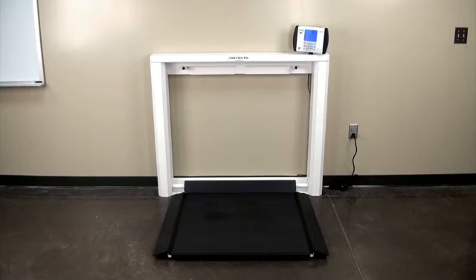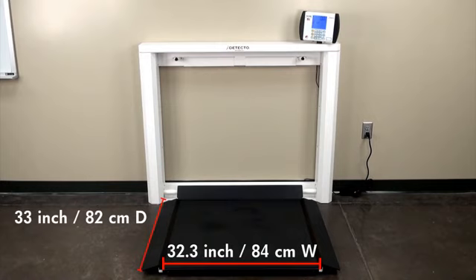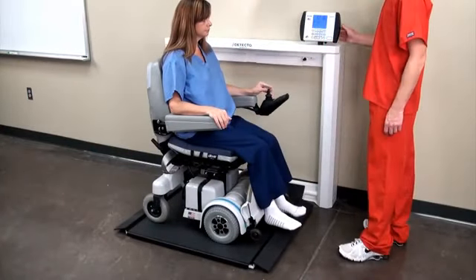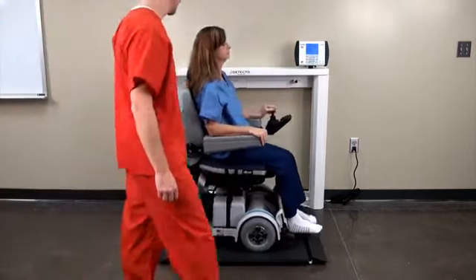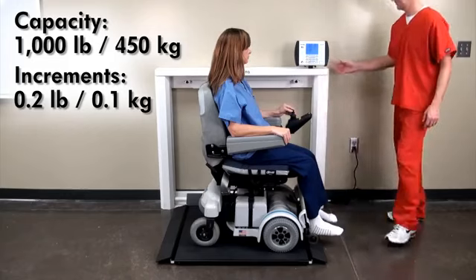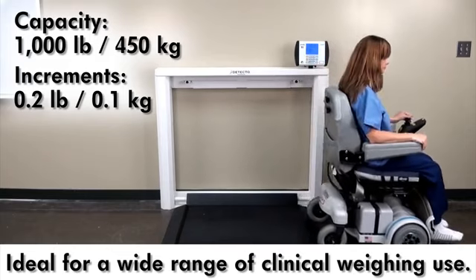The 7550 offers a spacious weighing platform that is 32⅓ inches wide by 33 inches deep — 82 centimeters by 84 centimeters — providing ample room for a variety of wheelchair sizes and types, including some power wheelchair sizes. The 7550 can capably accommodate bariatric weights with its high capacity of 1,000 pounds (450 kilograms), and its clinical-grade accuracy of 0.2 pounds (0.1 kilograms) makes this scale ideal for a wide range of clinical weighing use.